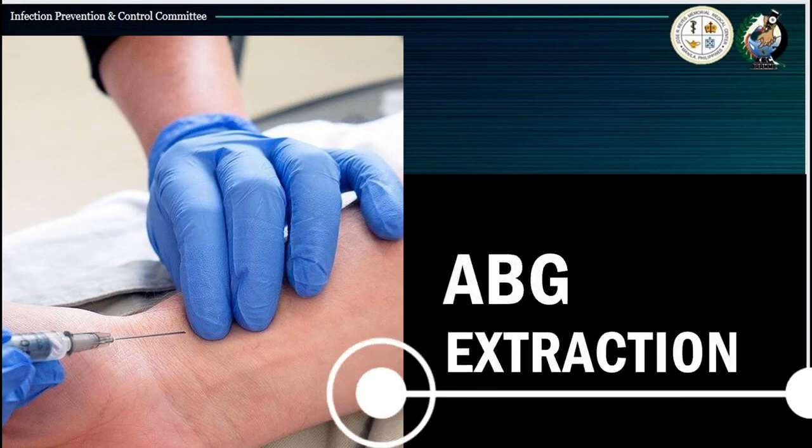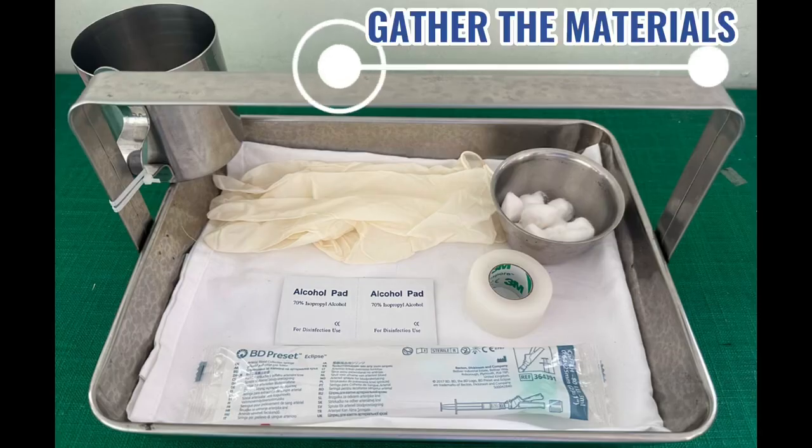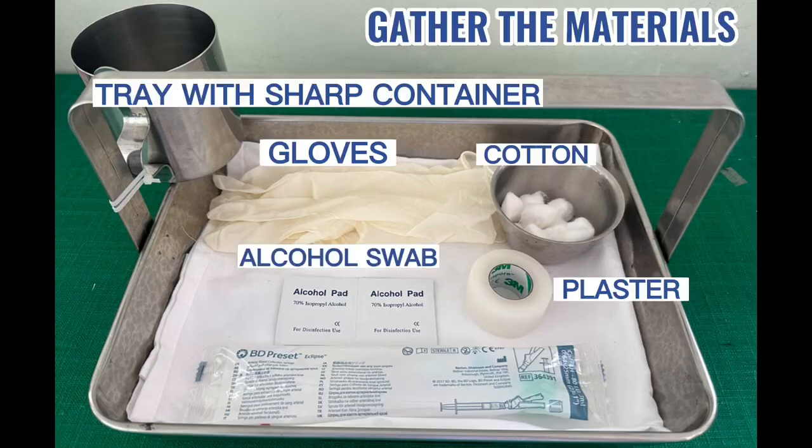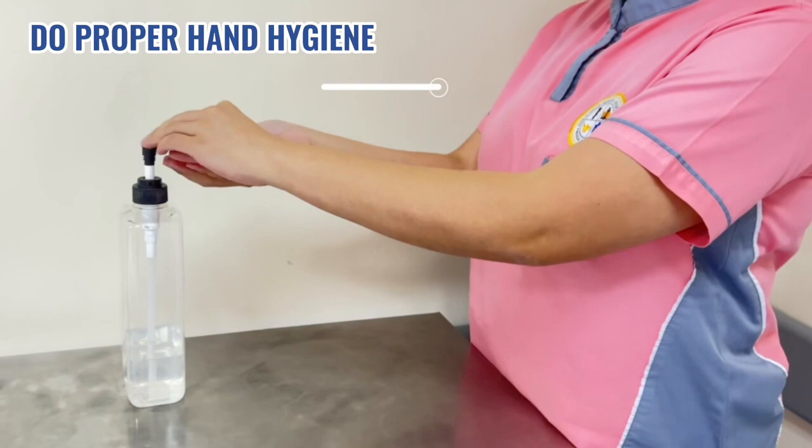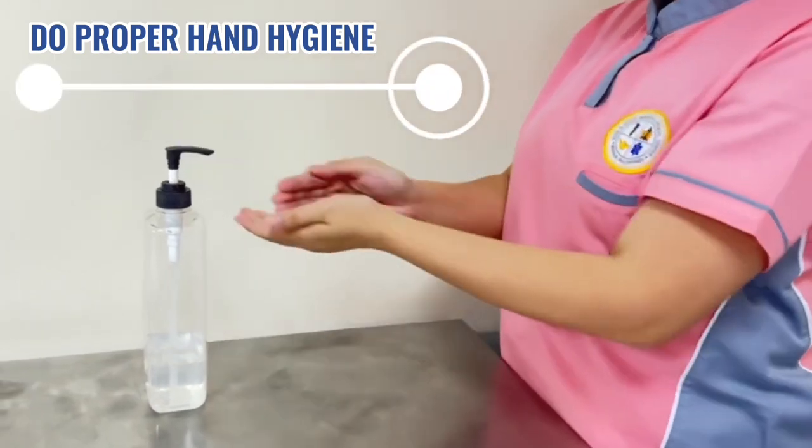And now, let's do the extraction. Start obtaining an ABG sample by preparing your materials. Do proper hand hygiene.